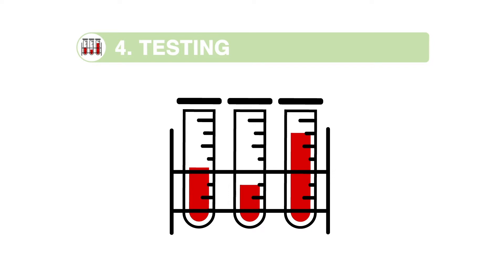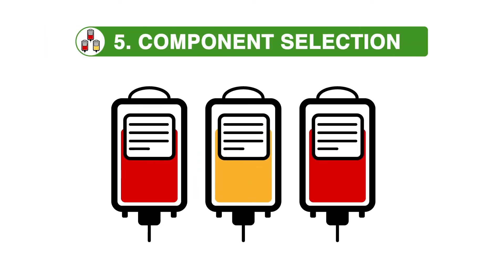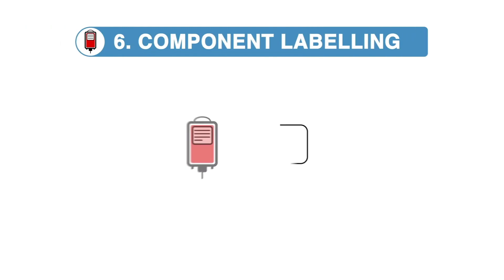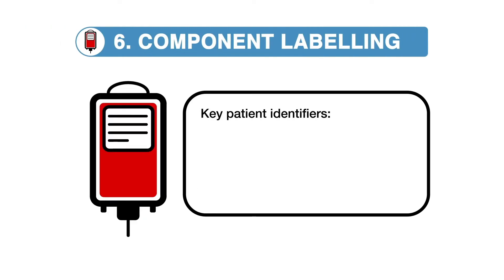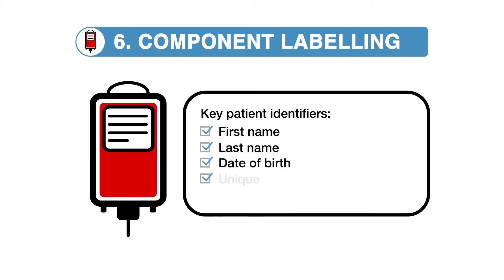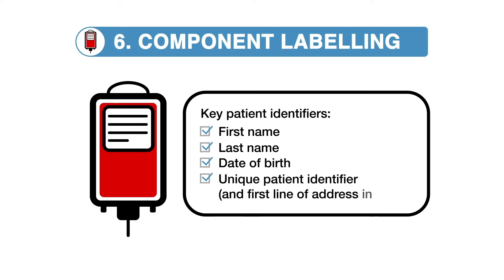Component selection: the correct components are selected to comply with the patient's requirements and the clinical request. Component labeling, availability, handling and storage: the right component needs to be labeled with the correct four or five key patient identifiers — first name, last name, date of birth, unique patient identifier, and first line of address in Wales — of the intended recipient. Components need to be accessible and available for the time required; if not, the clinical area must be informed, and components must be handled and stored correctly as defined in guidelines.